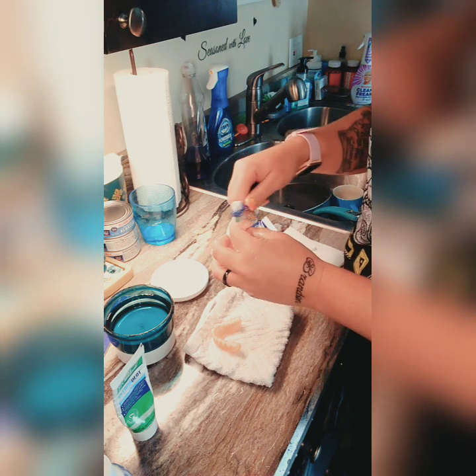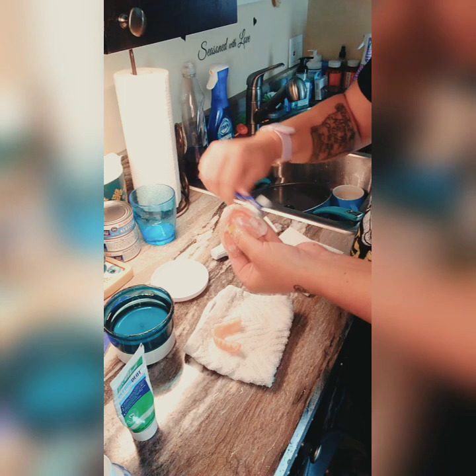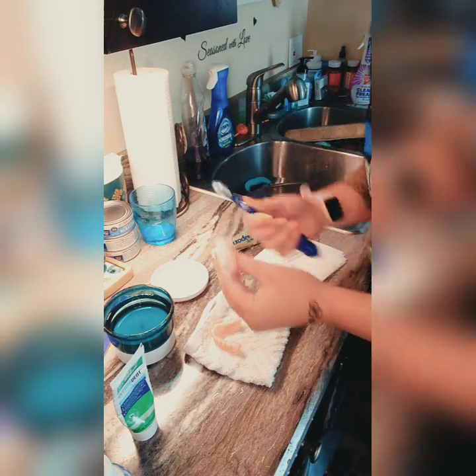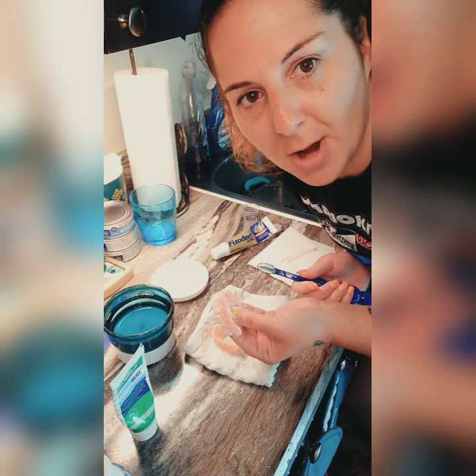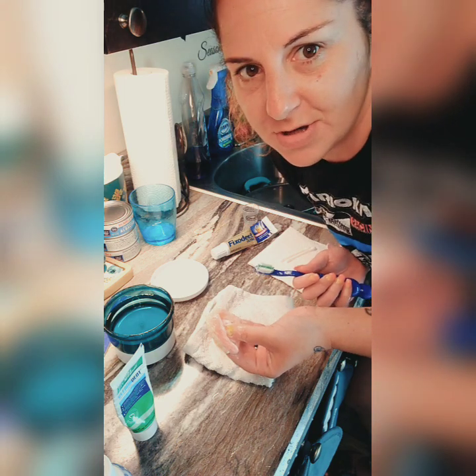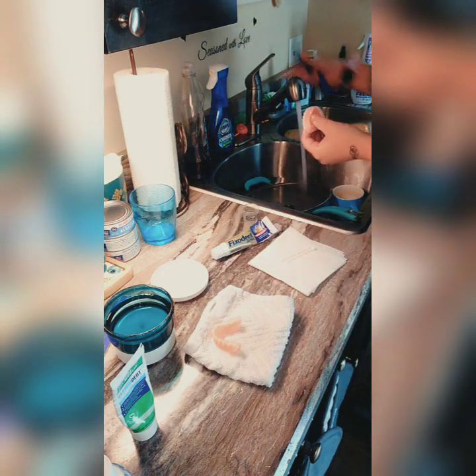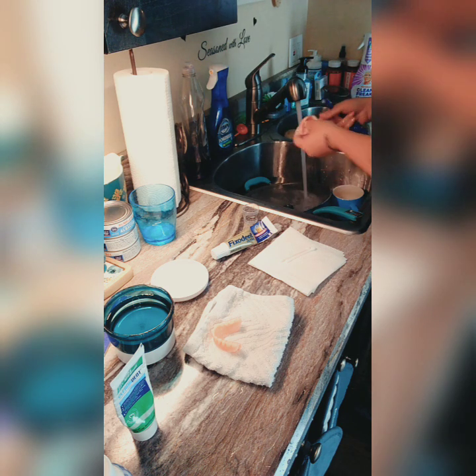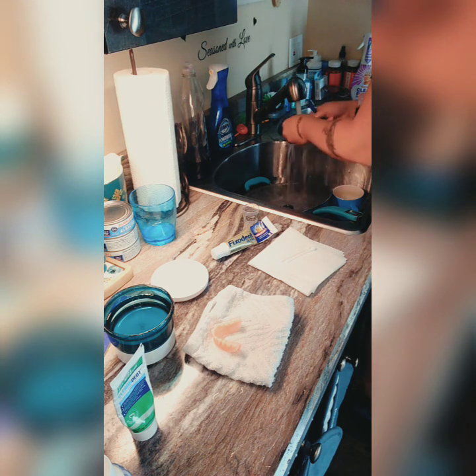Take out your denture at night to let your gums breathe. People ask me why they had great suction with their denture during the day but not at night. It's because the denture is literally smashing down your gums all day. When you take them out at night, your gums fluff back up while you're sleeping and go back to normal — that's why you get great suction again in the morning.